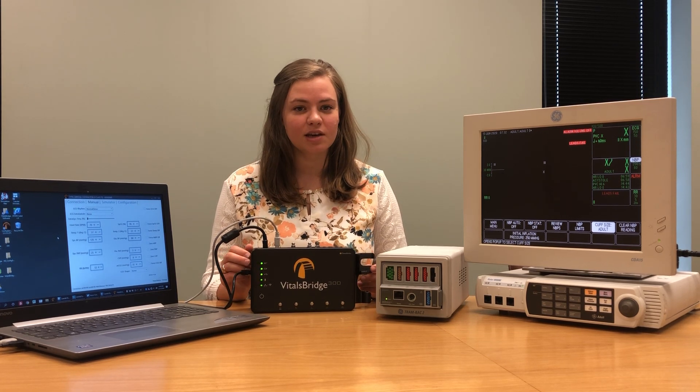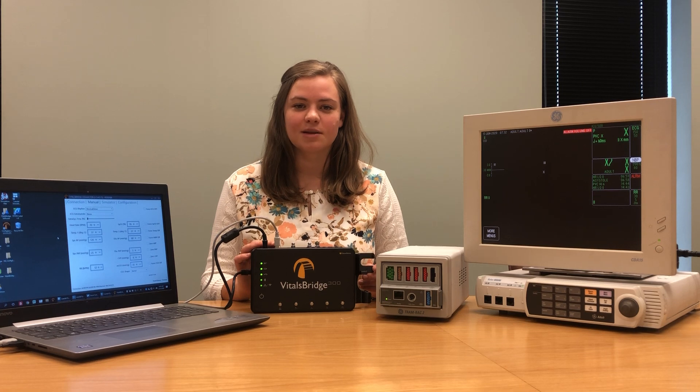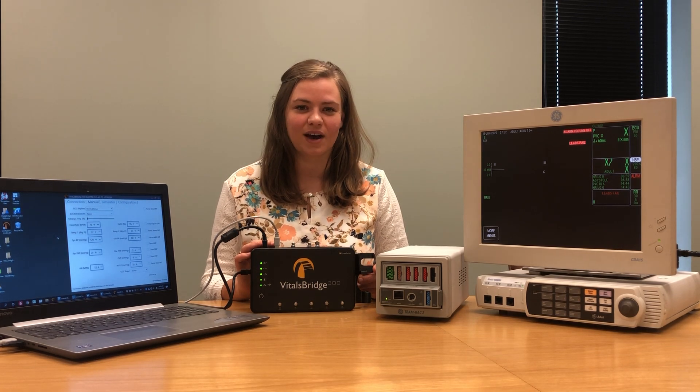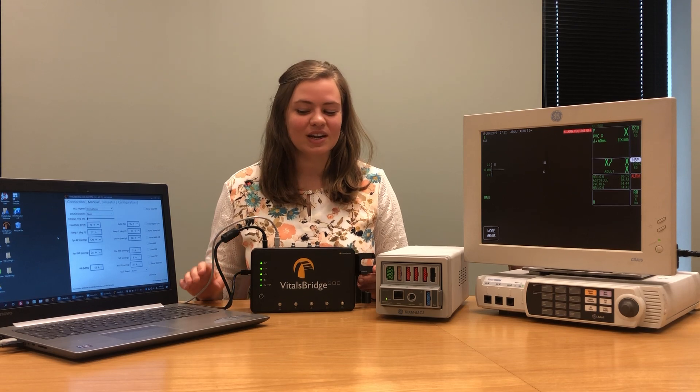If you're not using a computer you can also use any Android mobile device or tablet to control your VitalsBridge. Simply download the VitalsBridge connector app from the Google Play Store and connect your VitalsBridge to your electronic device via Bluetooth the same way you would connect any Bluetooth device. Let's get started.